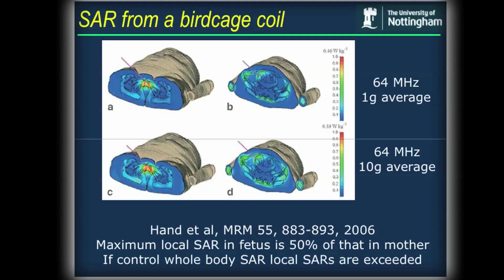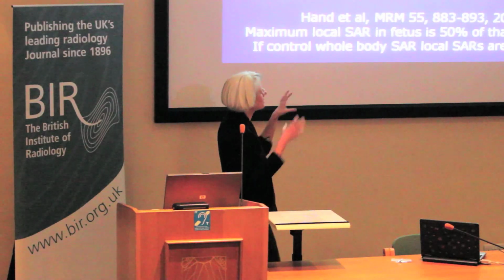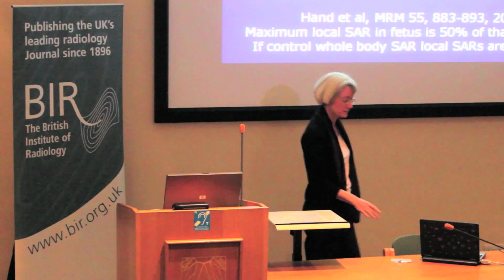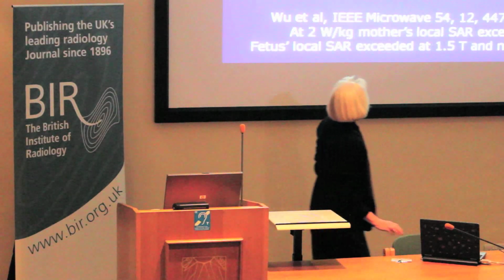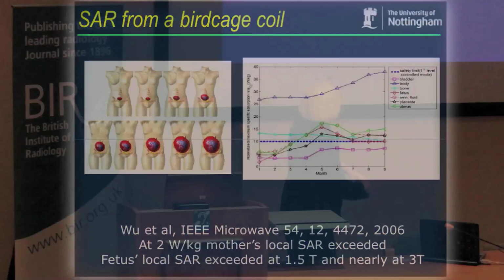So basically, it looks good. The fetus gets fewer local SAR hotspots than the mother. So the RF distribution is relatively uniform, and the fetus isn't getting particularly badly affected. It's not focusing in on the fetus. That's good news. Another study showing the same things, really. But that's not the whole story.